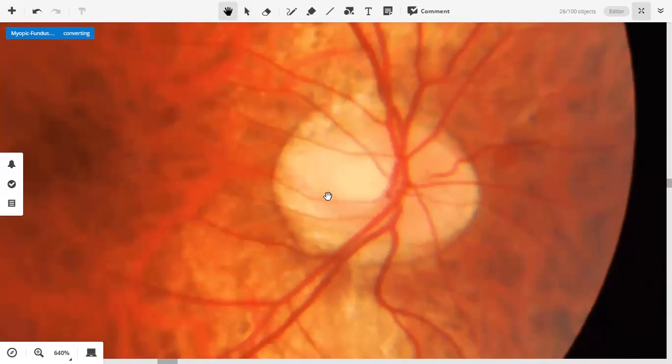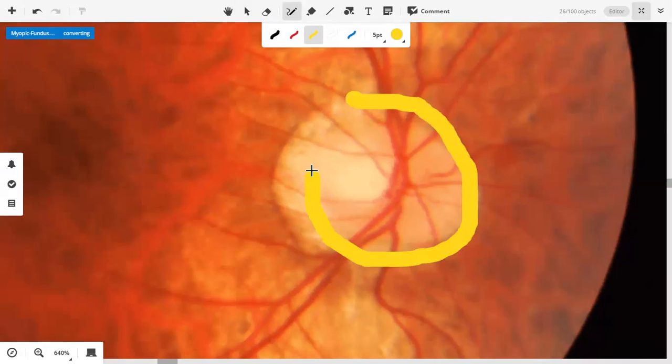However, these red vessels, they can be traced over here. But the retina, it appears to start somewhat temporally. इस बात की आपको समझ आ रही है? If I try to outline the disc, this is the disc. Yeah? डिस्क यहाँ पे खत्म हो रही है क्योंकि ये जो लाइंस हैं पीछे वो यहाँ तक मुझे आती हुई नजर आ रही हैं. But the retina, the outermost layer, it's starting somewhat here.